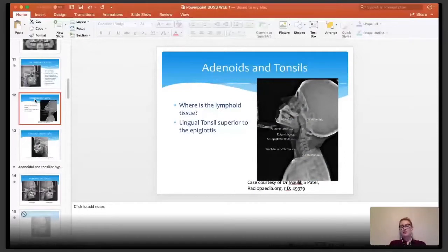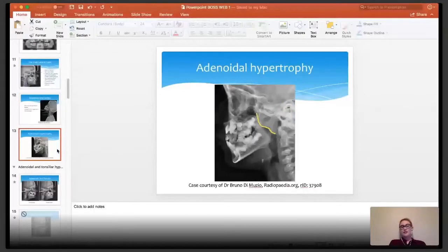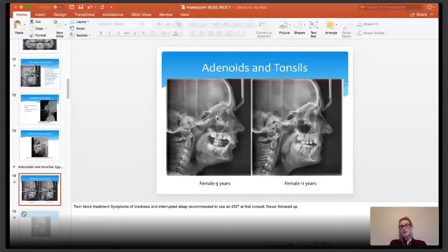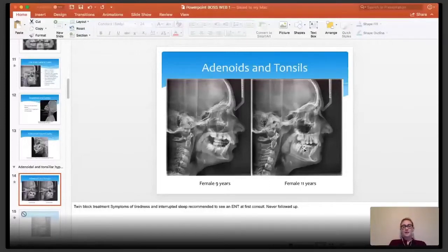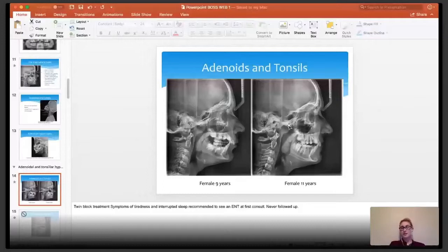It's also really great to have a look at the adenoids, the palatine tonsils, and any of the airways on the patient. Here's an example of what adenoidal hypertrophy looks like — there's quite an outline there. If you're seeing your patients regularly, you can compare the same patient over the years and see changes in her airways. It's much easier to monitor any changes — in this case, she's still got quite enlarged tonsils, and the adenoids have gone down just a little bit.